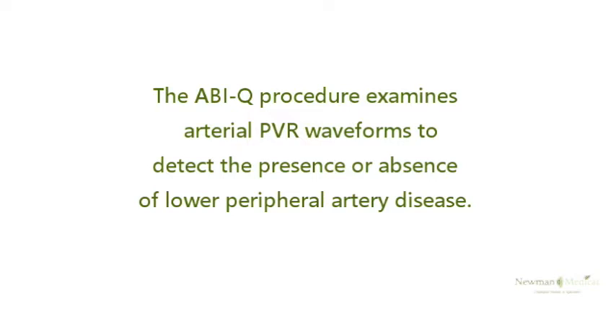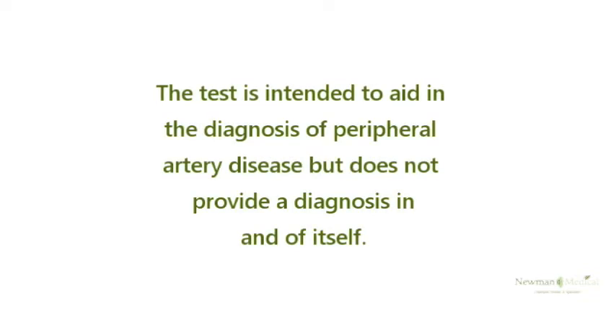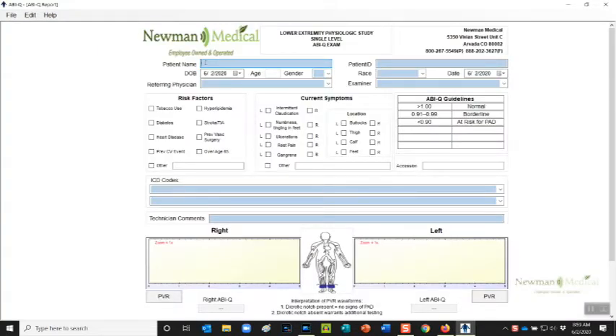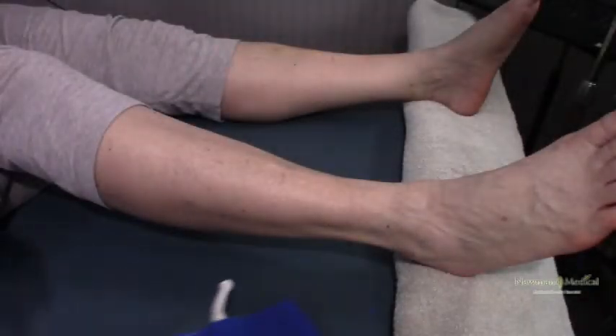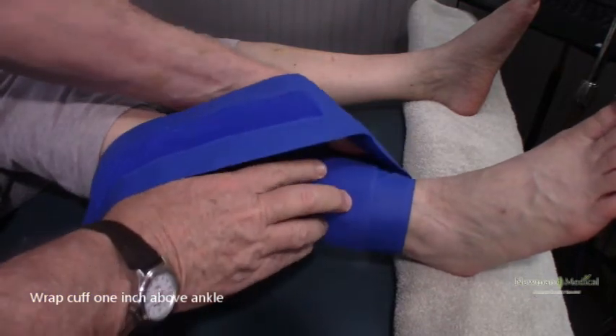Start by wrapping the bladder portion first. Place the cuff under the ankle and wrap it around the ankle, holding it in place with one hand while wrapping it with the other. Try to wrap it straight.